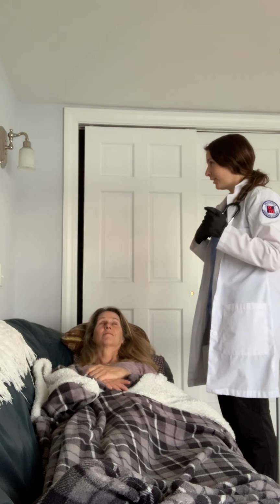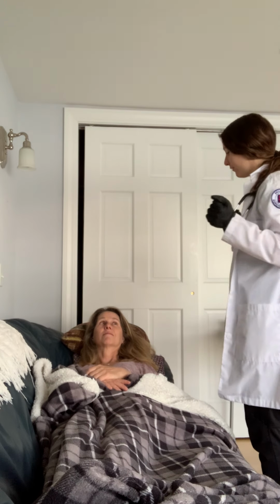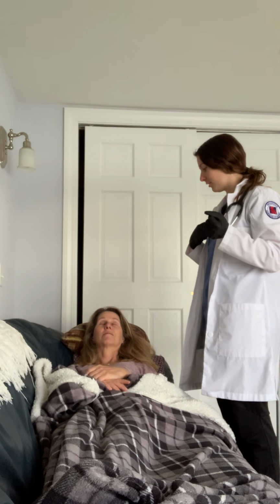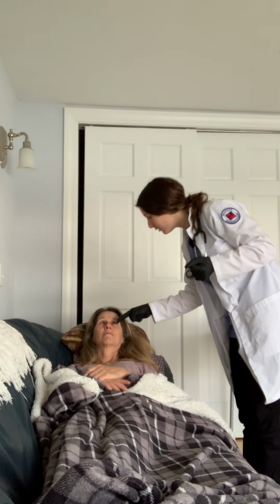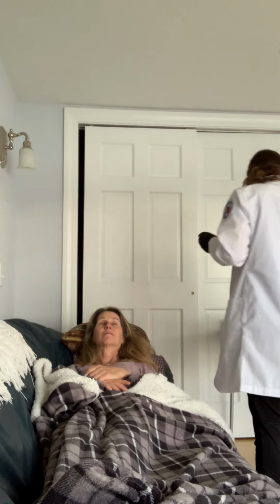So I'm going to check the health record to make sure that the placement of the tube has been verified by x-ray, and it has. So now I'm going to look at the marking that is right outside your nares and make sure that it matches the marking that's indicated in the documentation, and it's at a 2. I see that it's a matching 2 in the health record, so that's good. It indicates to me that it hasn't migrated.